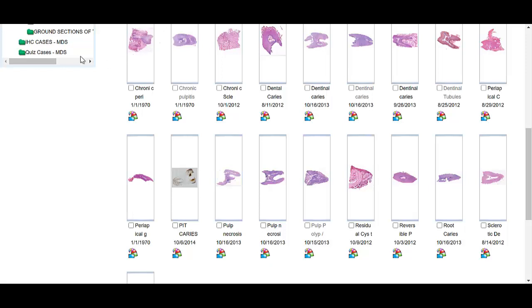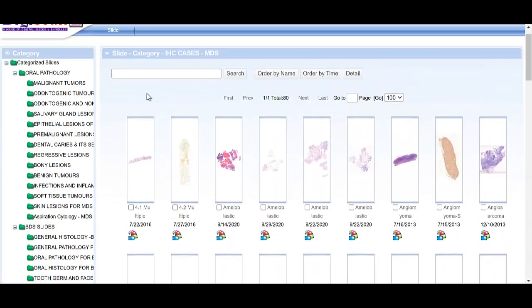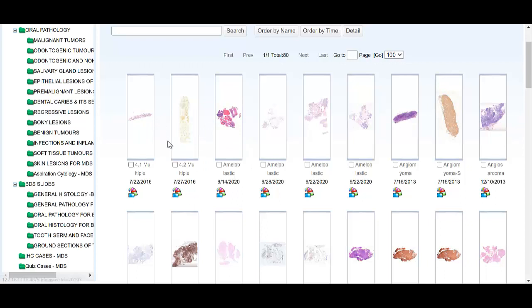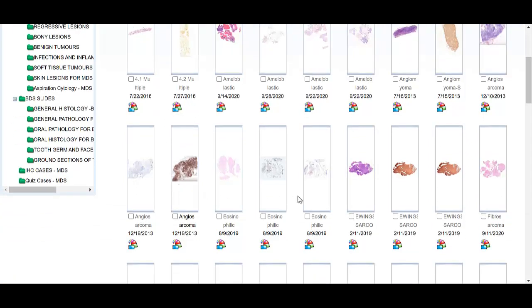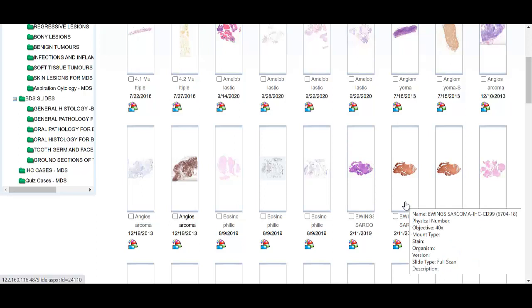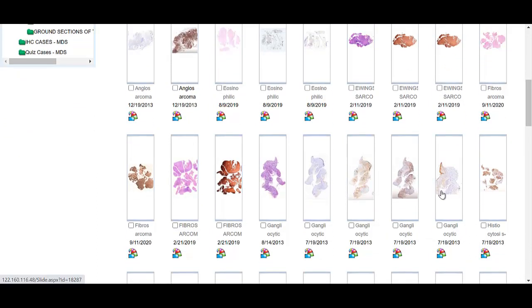We have a set of very well worked-up IHC cases of oral pathology, with about 40 cases shown. We have shown one H&E stain slide and the immunohistochemistry of the same case to demonstrate the pathology — for example, Ewing sarcoma with CD99 staining and FLI1 staining. These very well worked-up IHC cases help the postgraduate student in understanding correlation and how to arrive at the diagnosis besides morphological diagnosis.